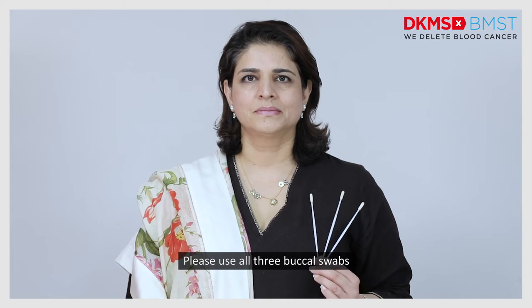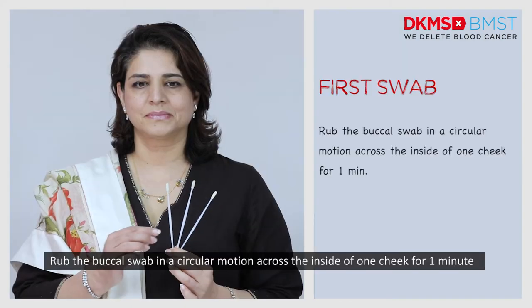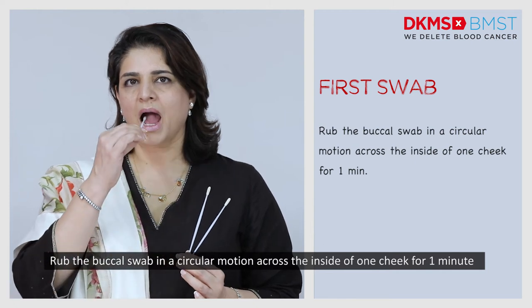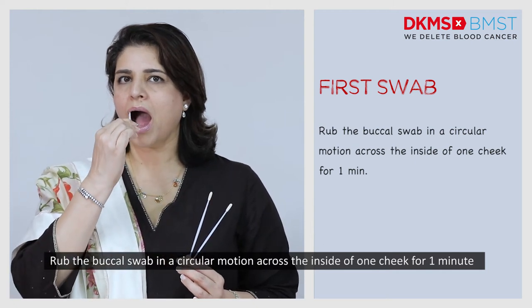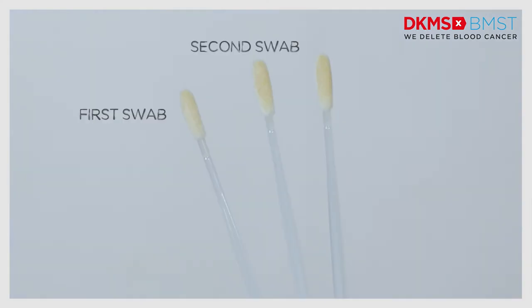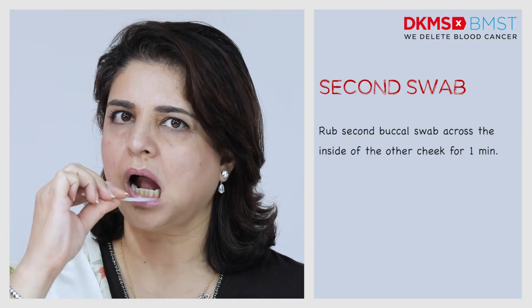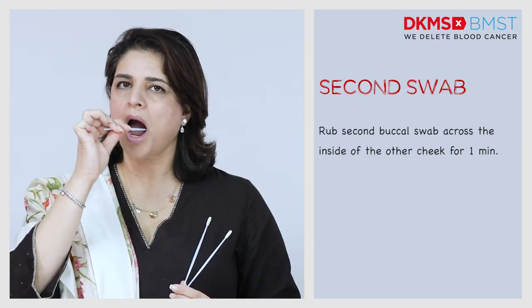Please use all three buccal swabs. First swab: rub the buccal swab in a circular motion across the inside of one cheek for one minute. Second swab: repeat it with the second buccal swab across the inside of the other cheek for one minute.